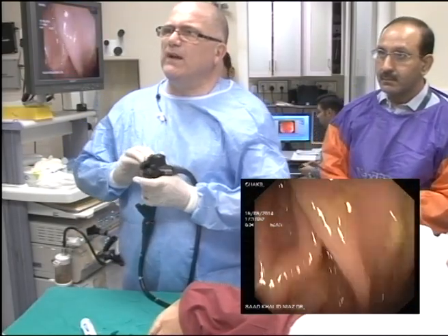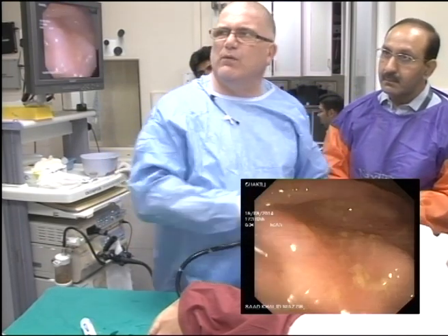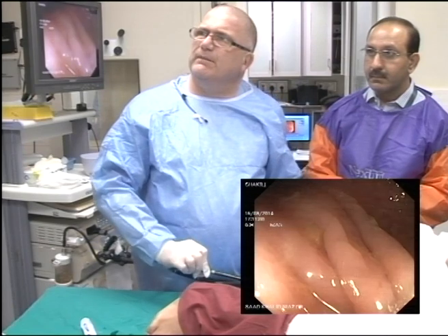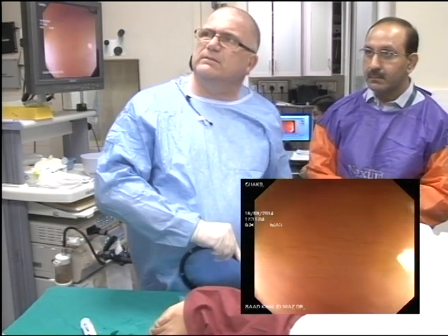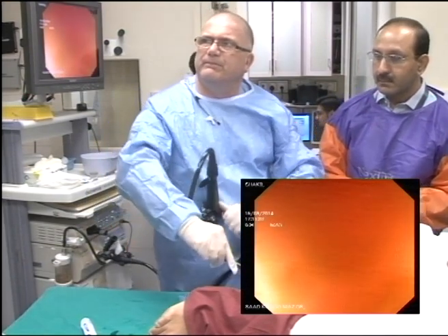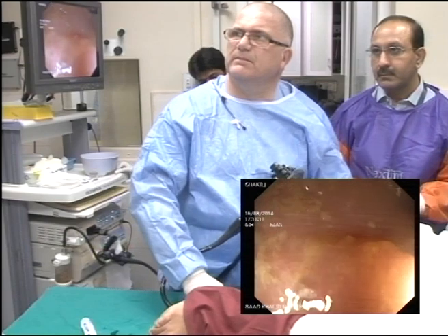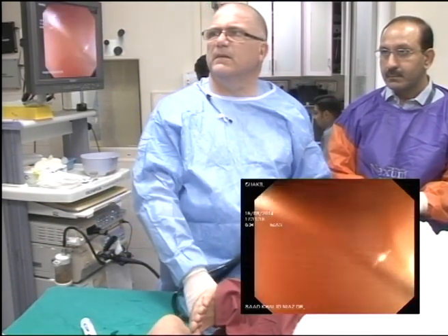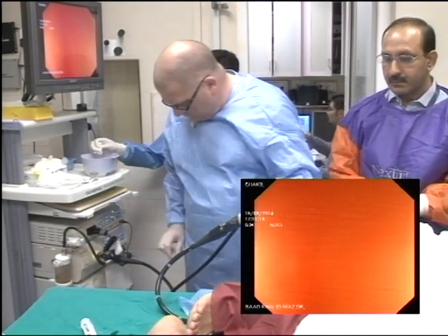The problem comes when you get people where we've put too much air in, then it becomes a real big problem because it shuts off at the flexures. I was just telling the delegates here that sometimes you put in so much air and make it so difficult that even when you hand it over to somebody who is very experienced, it's not very easy. So air is something that you need to be very careful with.